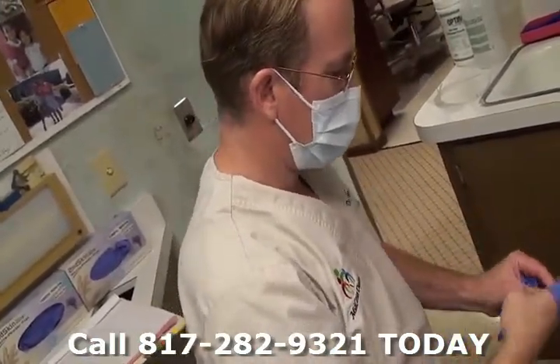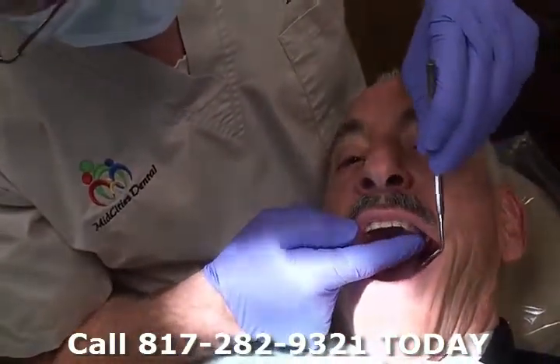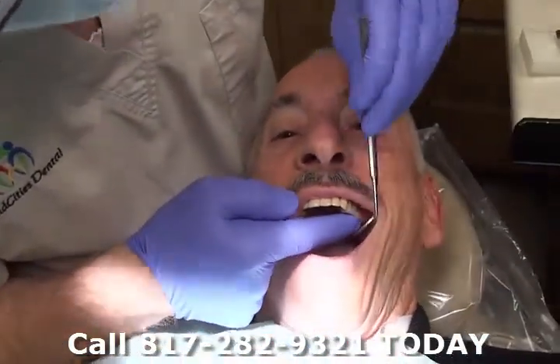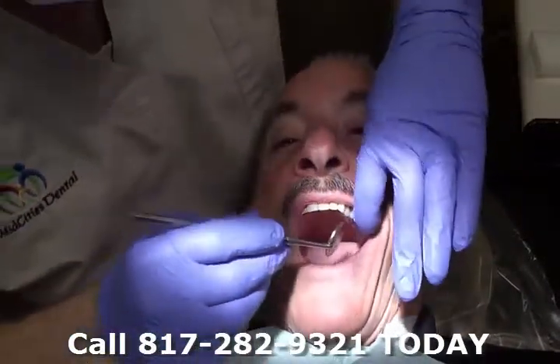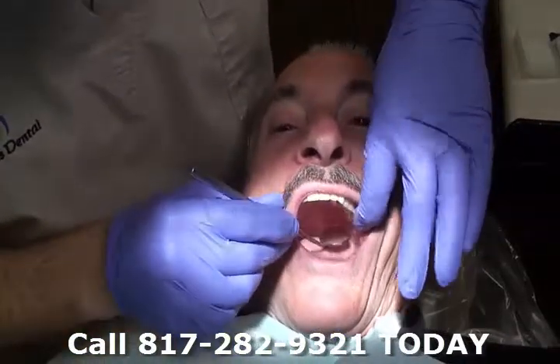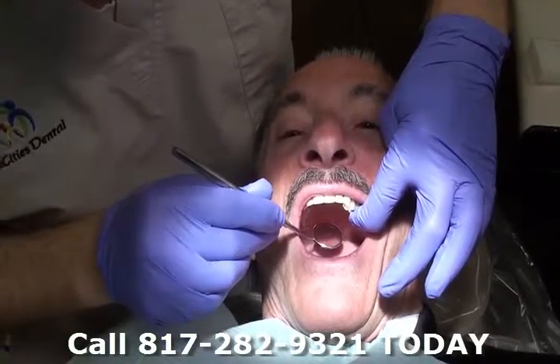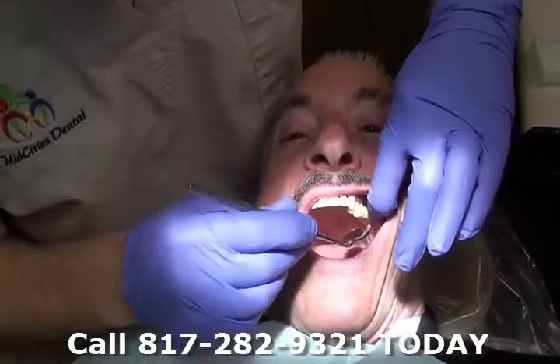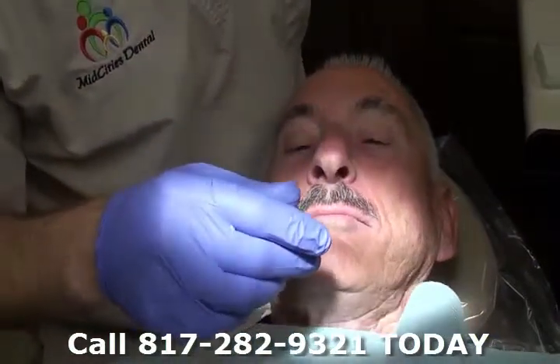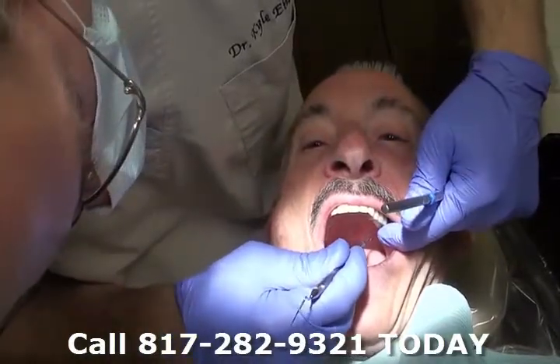Let me double check all that. The color looks great, Ralph. Look at that — it's very natural.